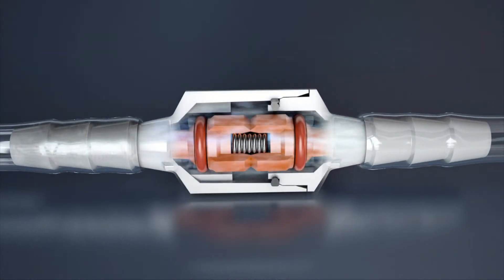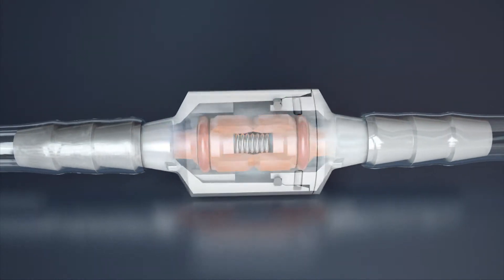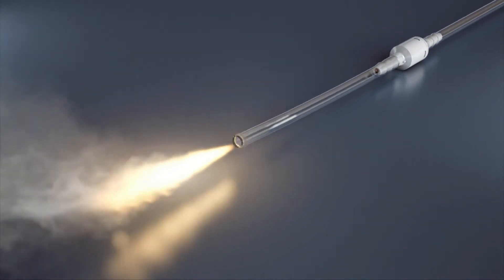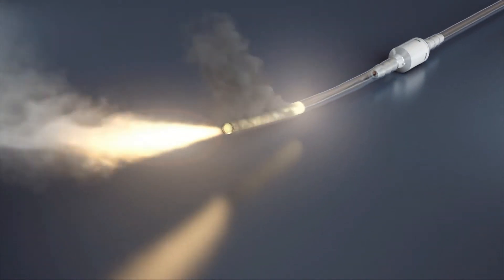When activated in a fire, the upstream tubing will pressurize. Ensure a firm connection is made with the tubing to withstand this pressure.